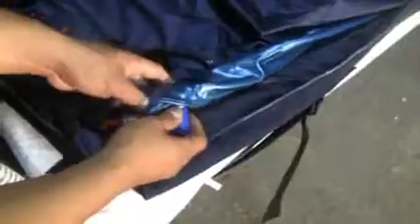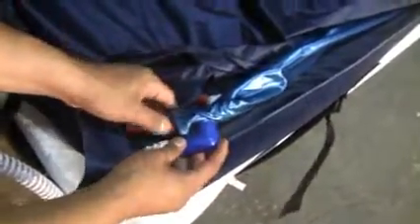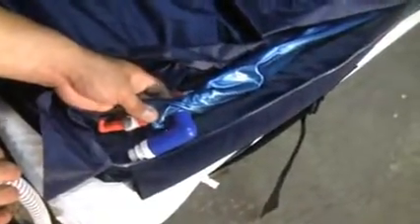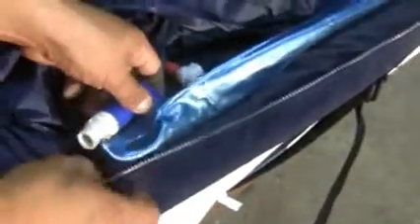On the foot section of the air manifold, you want to ensure that your air manifold is not twisted or kinked. If there is any twist or kink in the air manifold, it will cause an obstruction in the airflow. Simply untwist the air manifold so it is straight to relieve any kinks.